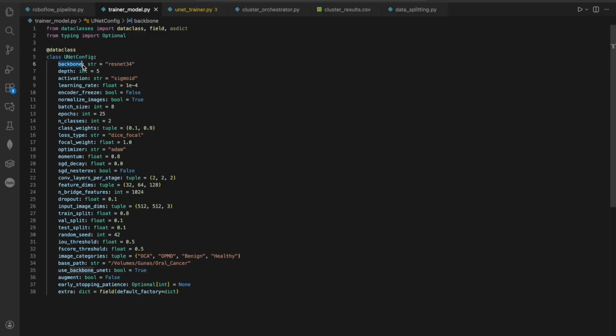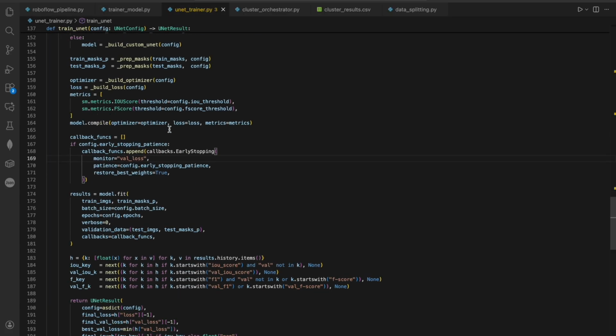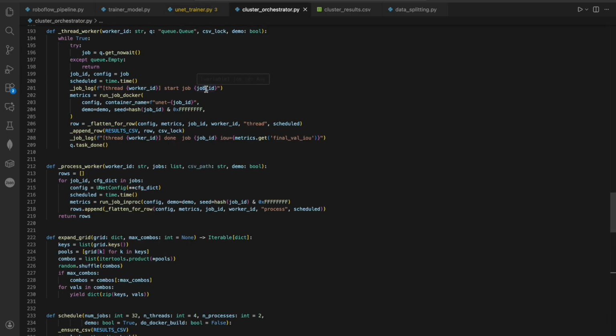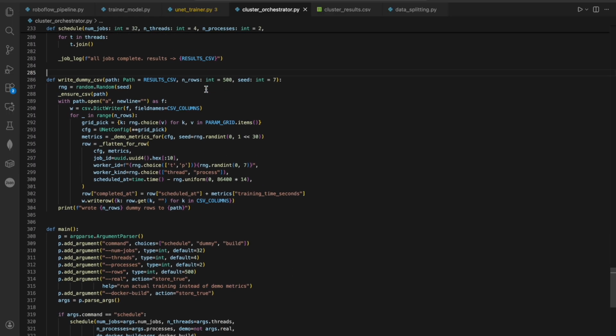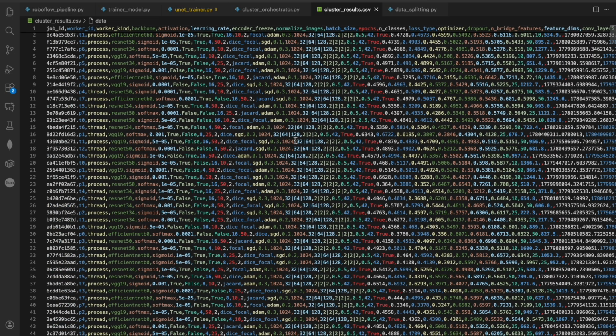For each U-Net, I ran experiments across different backbone architectures, model depths, and both model and training hyperparameters, capturing detailed performance metrics using this function. To sweep the full hyperparameter space efficiently, I built an asynchronous orchestration layer that fans each configuration out to isolated Docker containers, streaming every run's metric into a unified CSV file for downstream analysis.